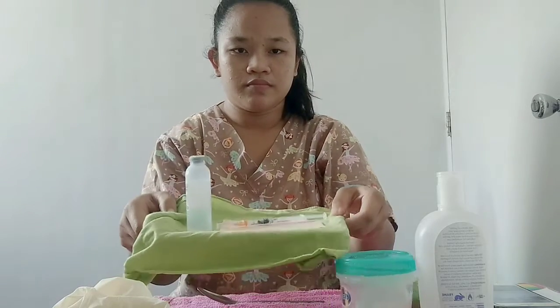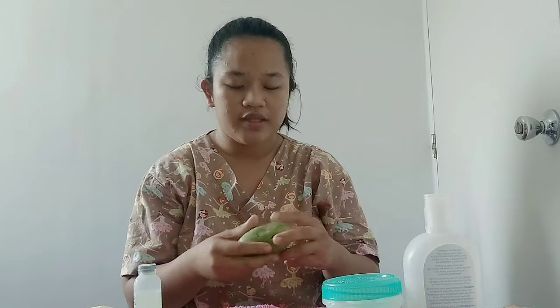Then next, we are going to perform hand hygiene. Then determine which side will be used. And then we are going to arrange the medication card in the hypodermic tray with the corresponding drugs. Then we are going to determine which side will be used and expose the site chosen. Let's assume that this is our site.